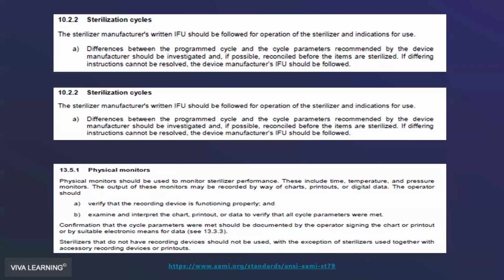And we have another question. When using a dental hygiene cassette with all the slots wrapped with blue paper and indicator tape, we have to use an inner indicator to tell if the steam penetrated properly. Absolutely. Autoclave tape is only a single parameter indicator. It only measures temperature. And so it tells you nothing on the outside with that single parameter indicator whether the steam has penetrated. Now, is it likely that it didn't penetrate into the cassette?